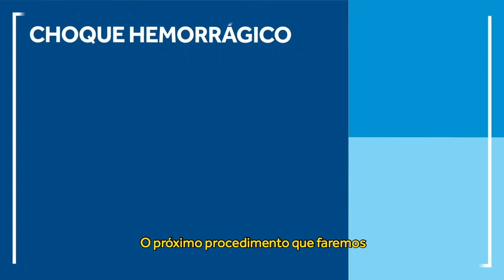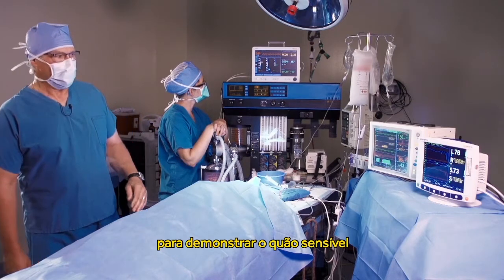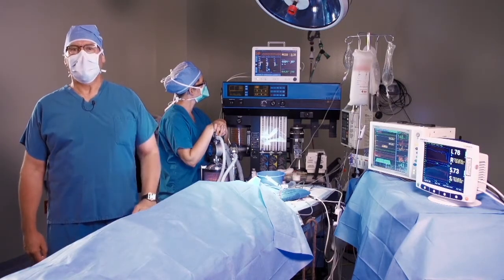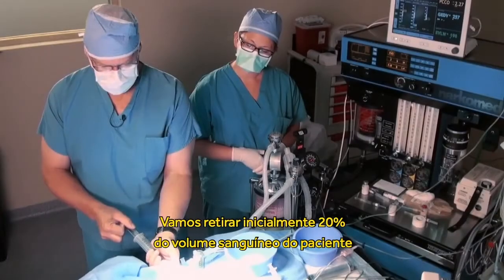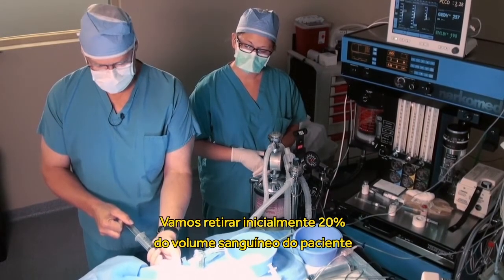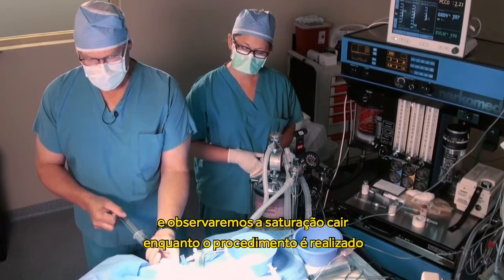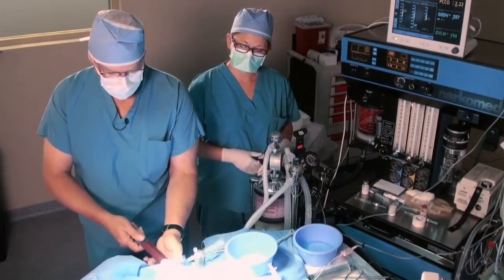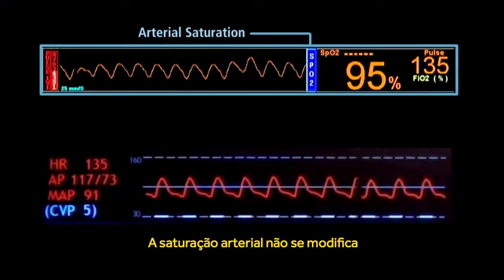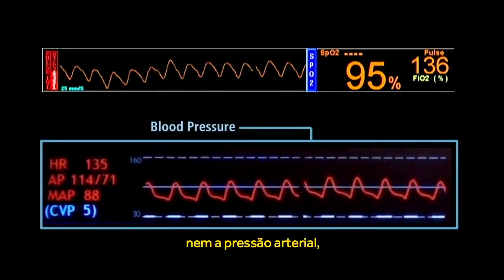The next procedure we will do is remove blood from the patient to demonstrate how sensitive the INVOS monitor is to changes in hemodynamics. So we're going to take out first 20% of the patient's blood volume. You will observe that the saturation will come down in a stepwise fashion here. The arterial saturation is not changing. And so far the blood pressure has not changed.